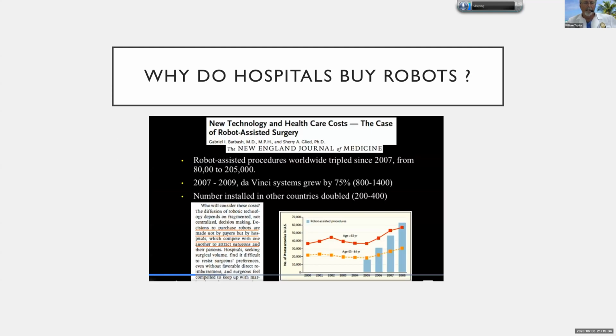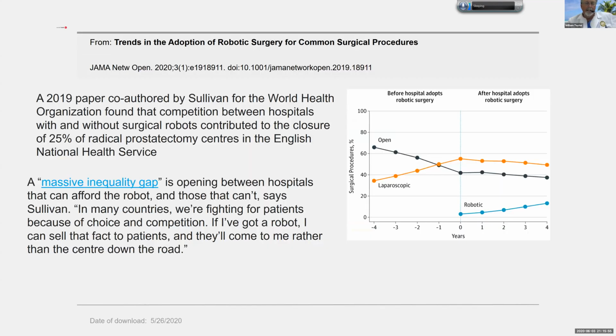The real question is, and someone asked that earlier, why should your hospital buy a robot? Why do the administrators in the hospital tolerate this expense on a robot when they give you a hard time about spending a few $100s on a revision case with some Infuse or something like that? And the fact of the matter is that if you get a robot and if you're doing prostate surgery, you increase your numbers of prostate surgery astronomically, you increase your profit, and you don't really decrease the number of cases. So you're not stealing cases from yourself by doing robotics.